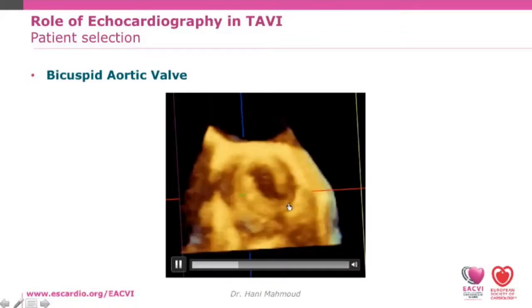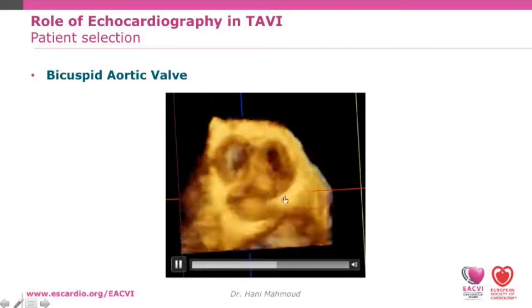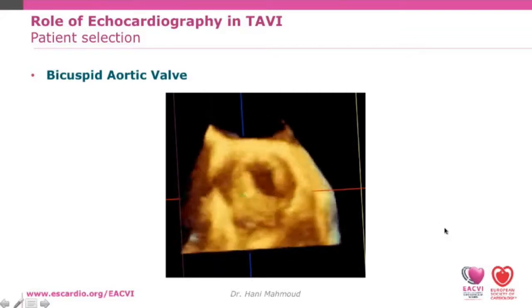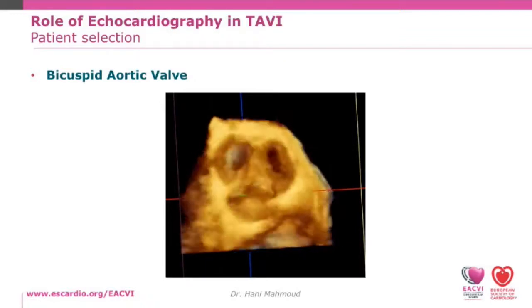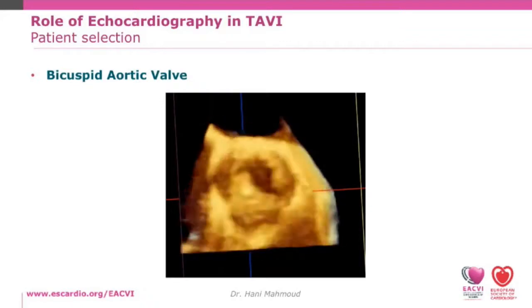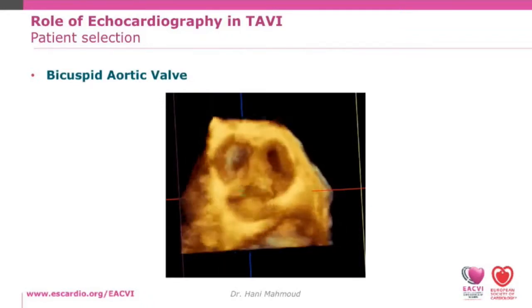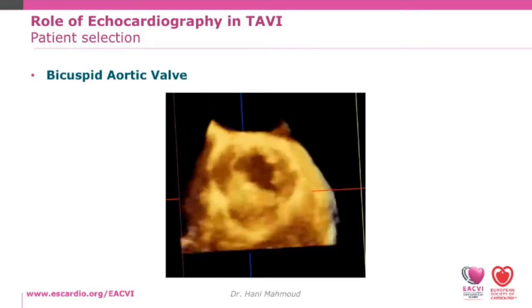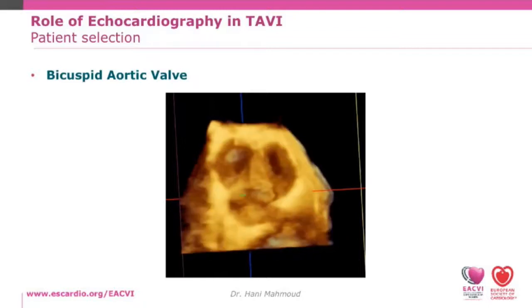That is because the elliptical shape of the orifice creates holes on either side of the prosthesis that make some room for paravalvular regurgitation. A second point is the risk of vascular complications, as those patients with bicuspid aortic valve have a really abnormal aortic root wall. That's why they have a lower threshold for surgery if they have aortic root dilatation.